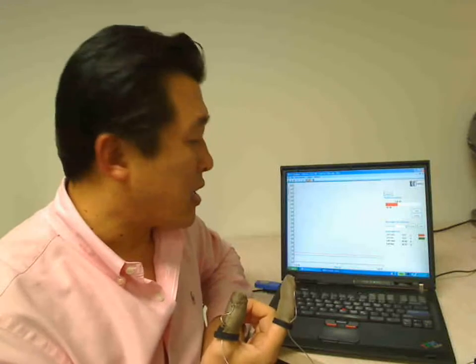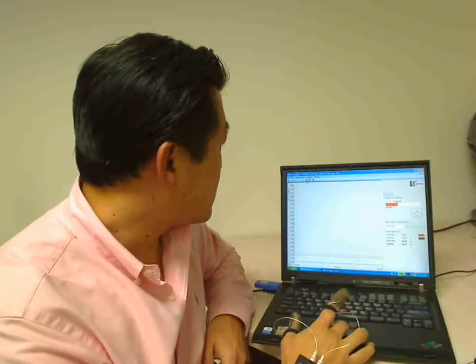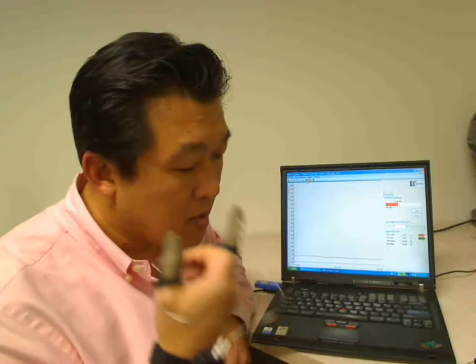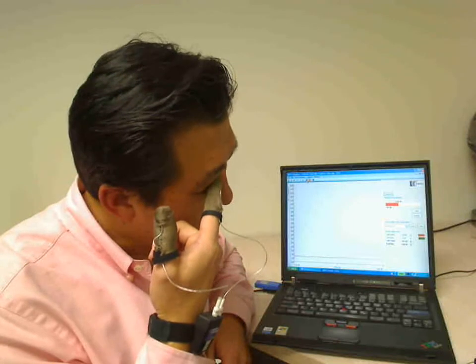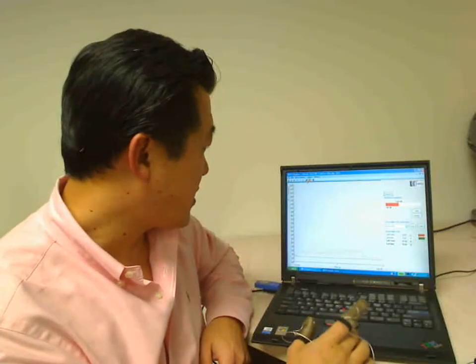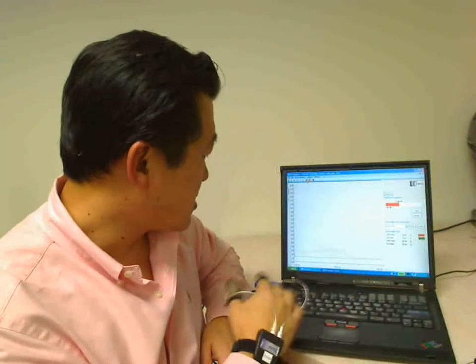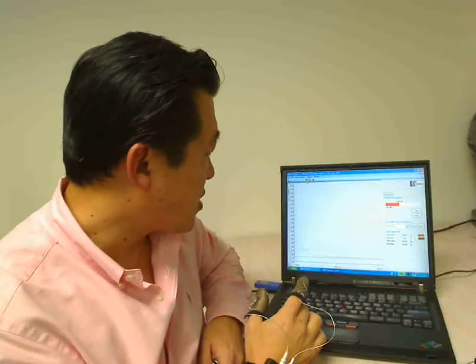Now for very light forces, we can try gently rubbing my eyelids — can't press too hard here. I've been doing this quite a bit because of allergies, and you can see that the force level is around 100 to maybe 150 grams. So here's a very quick, simple demonstration of how the finger TPS can be used. Thanks.